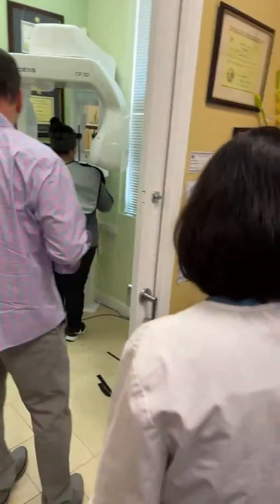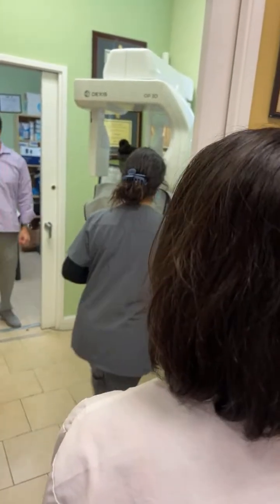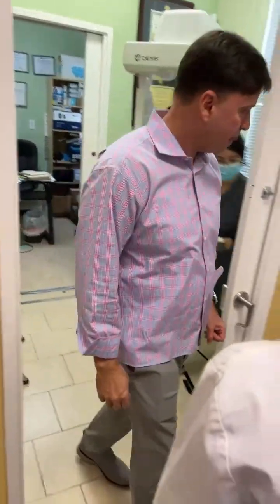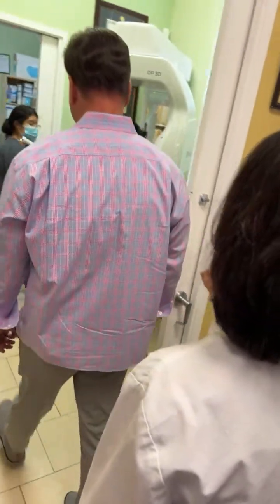So let's go ahead and hit the button. Do we have to have the door closed? Nope. Where's your exposure button? Does the scout have the radiation? Yes. Where's your exposure button? They had to run it out here somewhere. Oh, it's right here. They just did it that way.